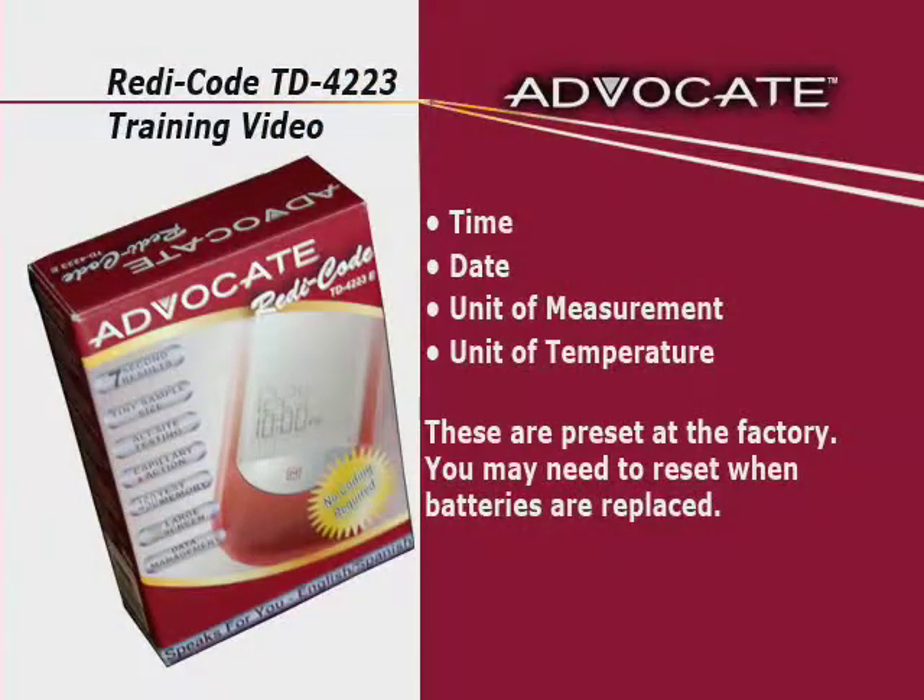Your meter comes with time, date, unit of measurement, and unit of temperature preset. However, if you replace the batteries, you may need to reset the settings of the meter.